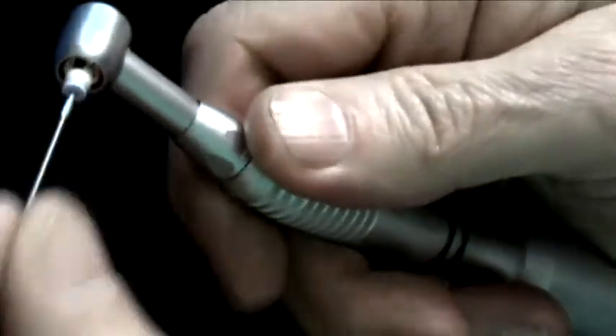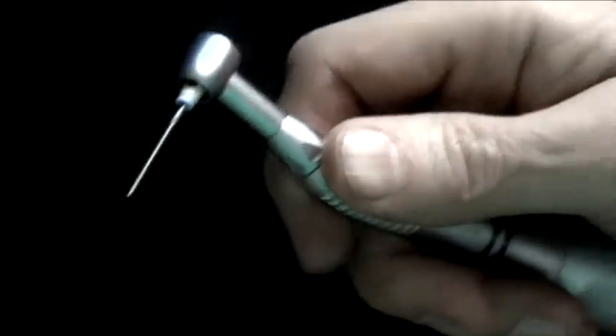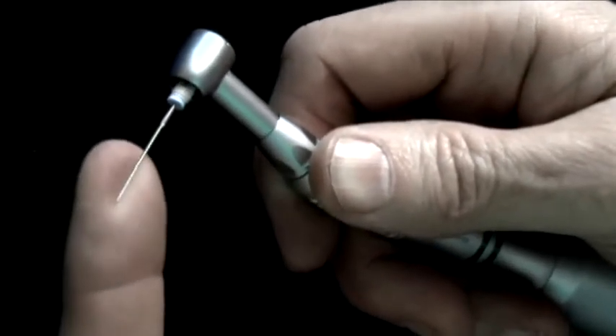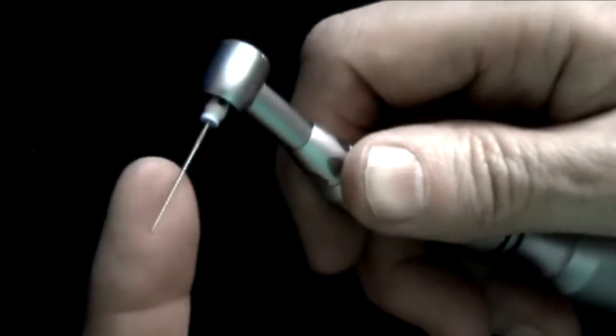Now let's talk about the magic of the EndoGripper handpiece. The EndoGripper is a standard E-type contra angle, which fits onto any standard E-type motor. The real magic of this is it has a push button device — and let me just go to the close up here. By pushing this button on the end, it will slip right over any standard hand file. Then you turn it on and it's vibrating at about 2,000 cycles per second. It's kind of like a power sander.